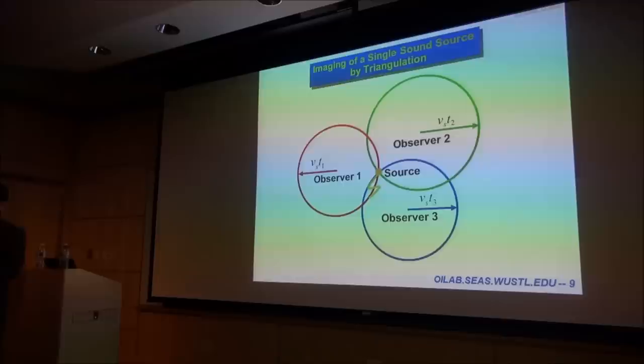On top of it, you have to scan again rotationally. So in photoacoustics, you realize that we only need to do one of them. Oftentimes we do a rotational scanning or simply use a ring geometry for parallel detection. Plus the time, that's going to give you everything you need. So the scanning can be extremely fast in that regard. So that's the basic principle, really.